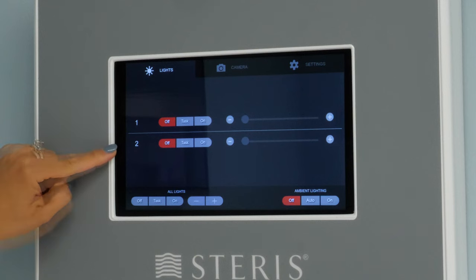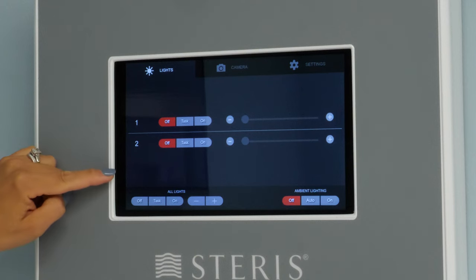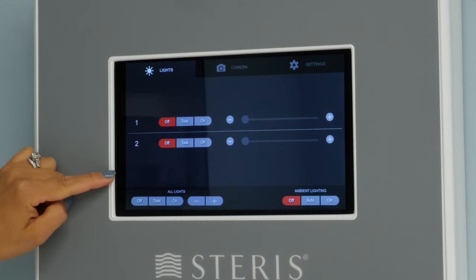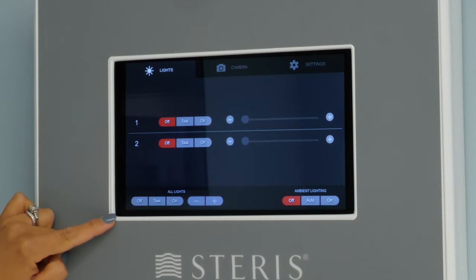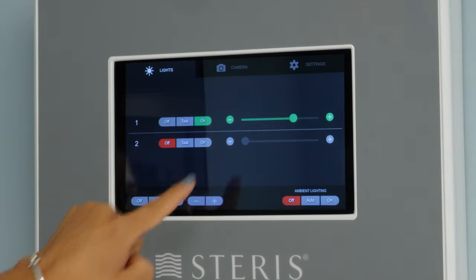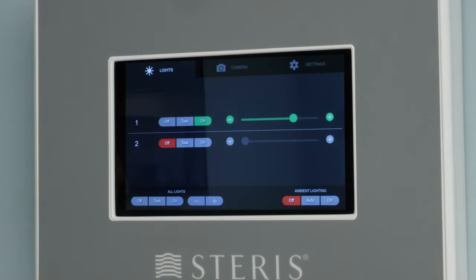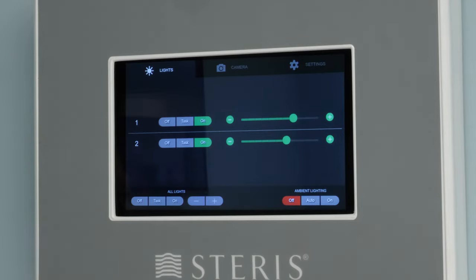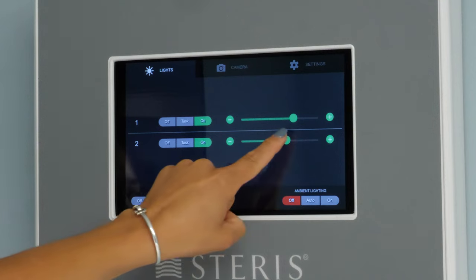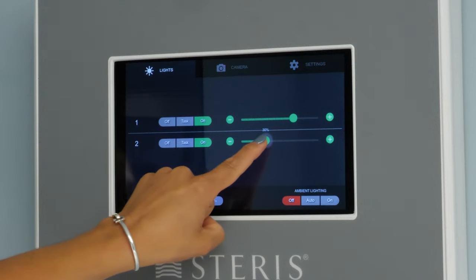If you had three or four lights they would be listed below. You can control the lights independently of each other or all together here at the bottom. Think of this similar to an iPad where you can simply touch the screen where you want the light to turn on, or you can drag the control for the intensity.